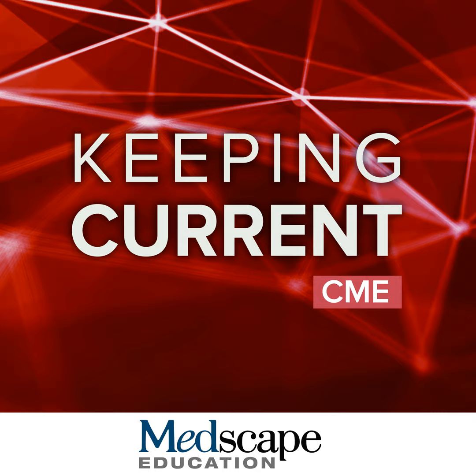Here's a couple of other cases. Here is a lesion in the left hepatic lobe that is mildly T2 bright. You can see the gallbladder in the same image. That would be benign bright. This is definitely not that.